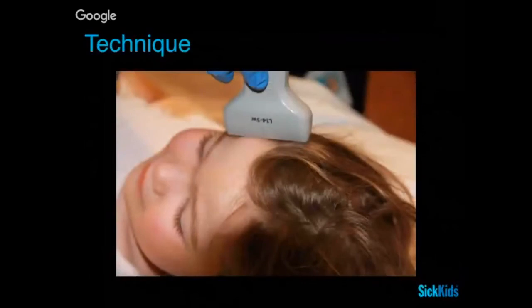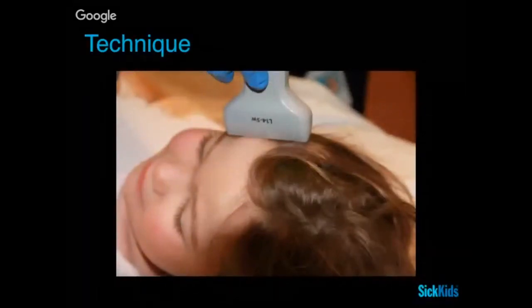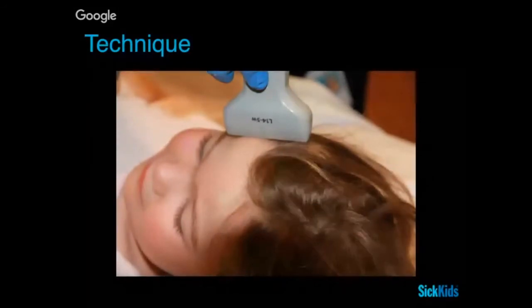The technique now is really as when you do a kind of soft tissue scan. So you have your linear probe, you want to scan the area of interest. And usually what I would advise is to look first to make sure that you know where the nerve is, where the vessels are, where you're going to be willing to do your local anesthesia, because then you know where you're going to be poking. So I would definitely recommend to just have a quick look first. Then prepare the patient, put the local anesthetic on, and get everything that you need.